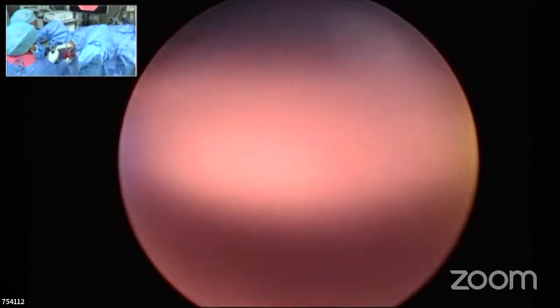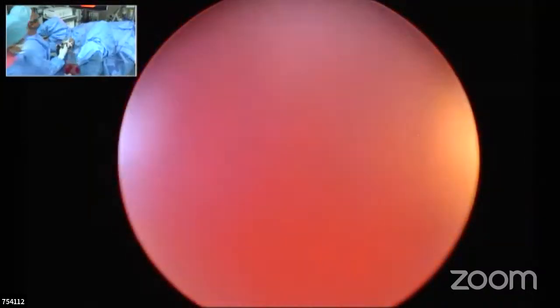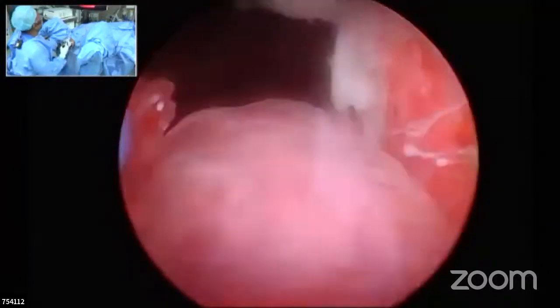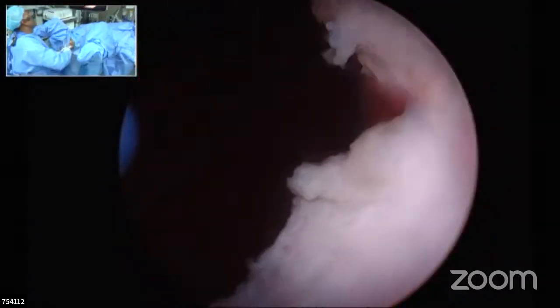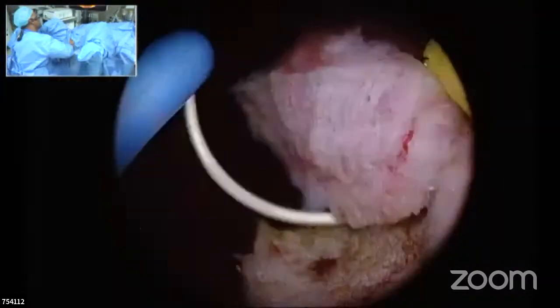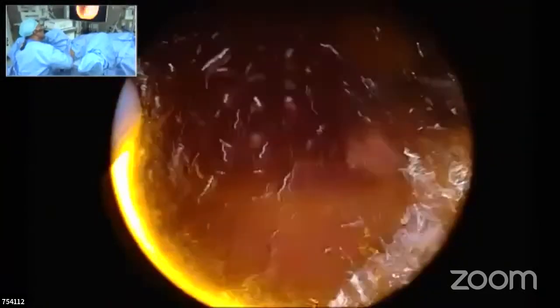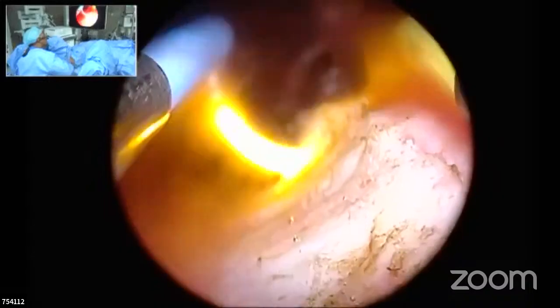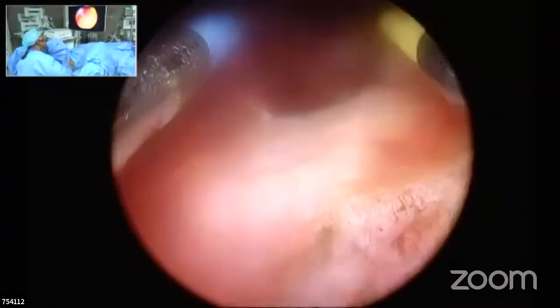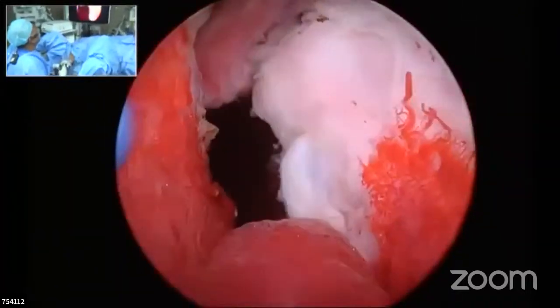But if it is a smaller gland, after you have resected, do you put two incisions on either side and leave it so that you can avoid contractures? Does that help? I don't think so, sir, Keshav. Bladder neck contracture is not because of a narrow bladder neck alone. People have developed bladder neck contracture even in a wide bladder neck. You don't need an incision. Incision prevents it only when you have a narrow bladder neck at the end. By giving an incision, you are creating a wide bladder neck. But even otherwise it can happen. That's the reason why.